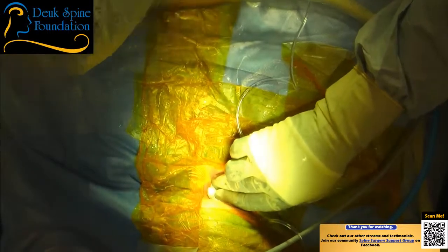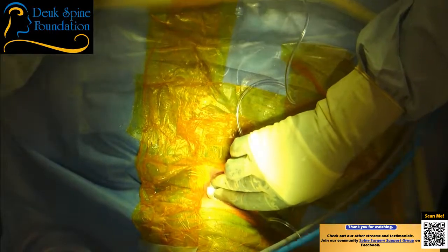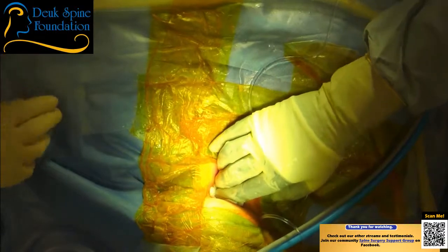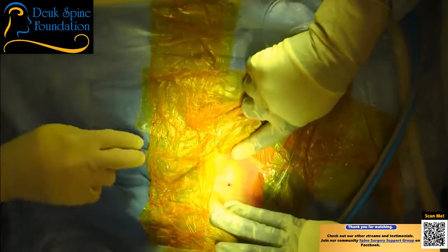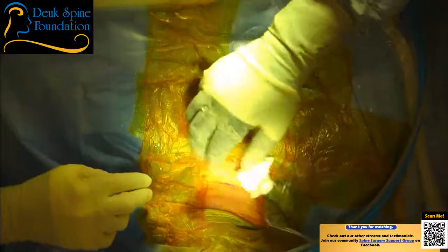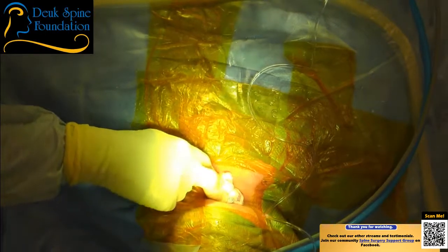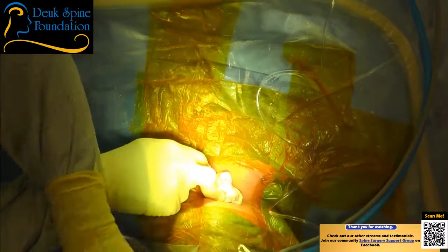So, remarkable surgery in many ways. Blood loss 1 mil. I'm going to show everybody the incision. This was a tougher one to do than the last one because she had more soft tissue. But we got it done as a team. All right, there's the incision. You all see that? Sean? Yes, we do. Beautiful, huh? Tiny little incision. Luis will hold pressure for another 3 minutes, and then we'll put our little bandage on, Steri-strips, and we'll be done. Next is going to be a lumbar Deuk laser disc repair.